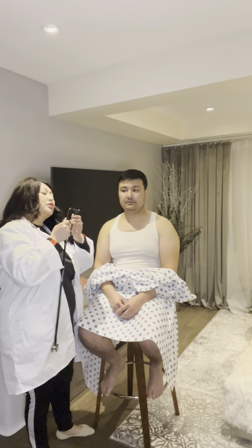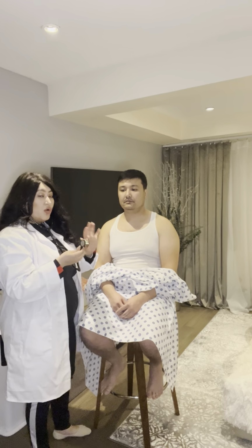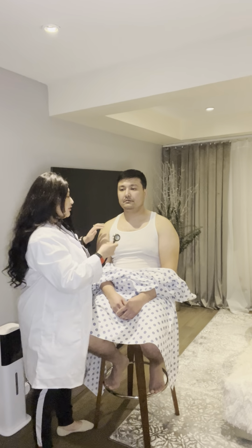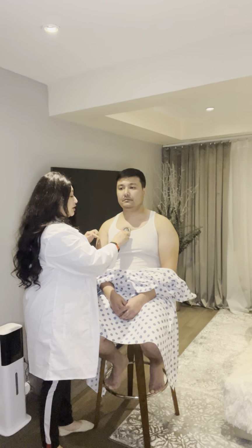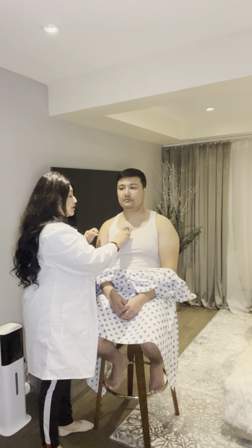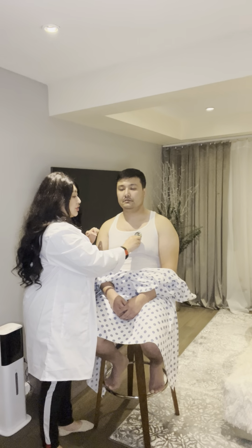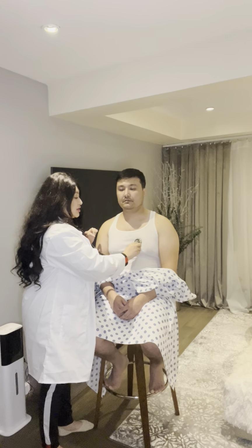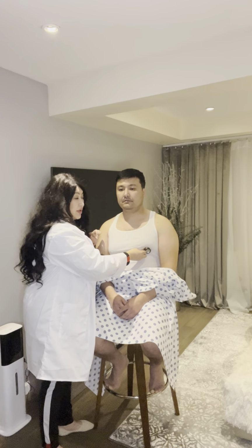Next, I'm going to auscultate with my stethoscope, with diaphragm and bell, all 5 cardiac areas. I'm starting with diaphragm. Starting right here on the right side of the sternum, second intercostal space for aortic. Moving to the left at the second intercostal space for pulmonic. Down one, third intercostal space, Erb's point. Fourth intercostal space for tricuspid. And fifth intercostal space for mitral.